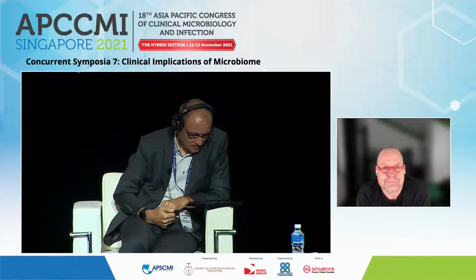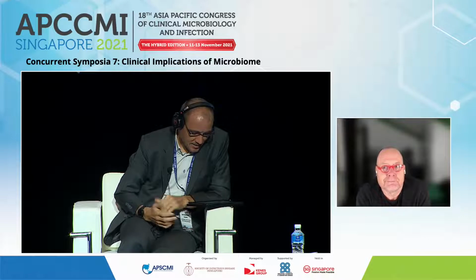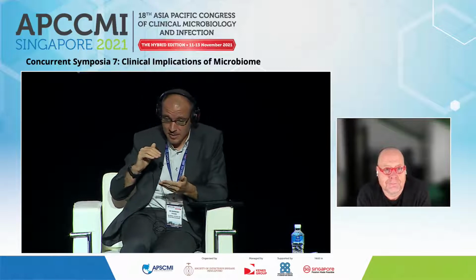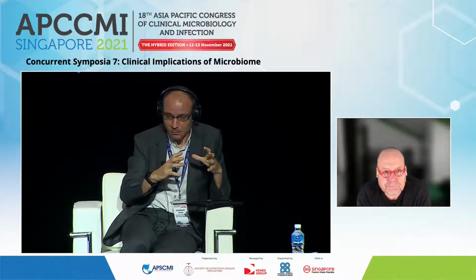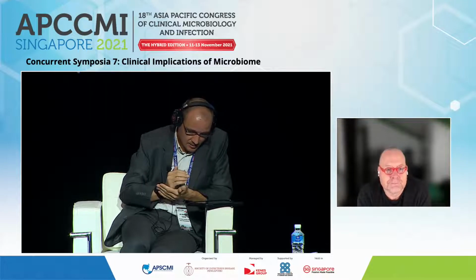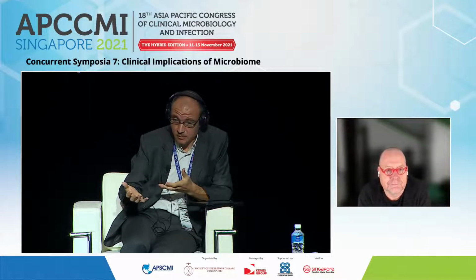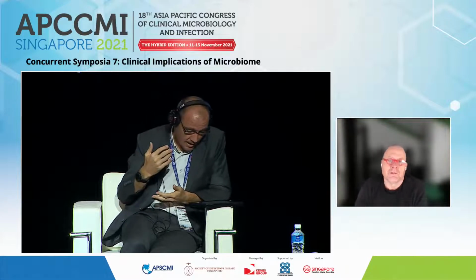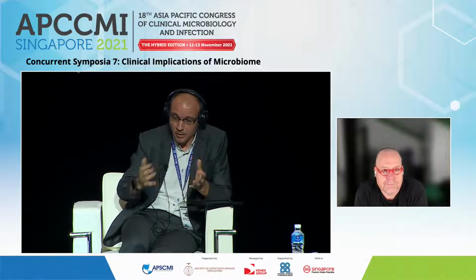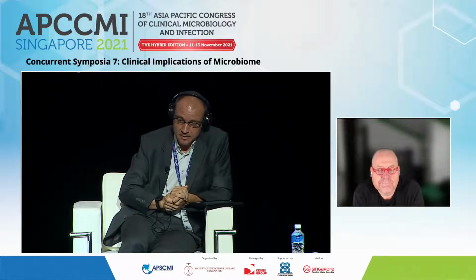Okay, thank you. And a question here from Gabrielle Yunn. One of the issues with the use of unbiased sequencing, as you did touch on, was determining what is signal and what is noise. Is that something that needs to be worked out for each individual sample or each individual illness? And what is the best determinant to use? For example, would it be the number of reads or how good the genomic coverage is for the suspected pathogen?